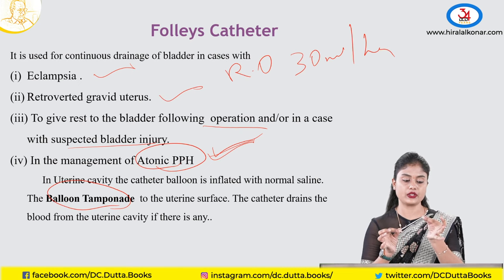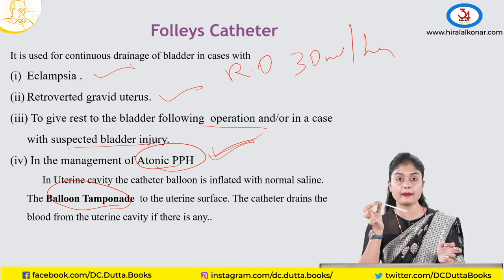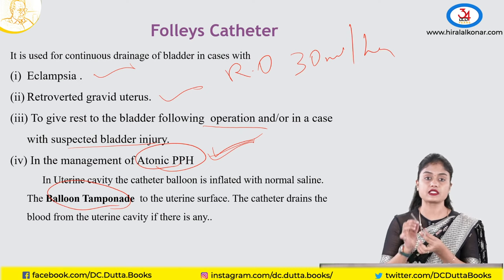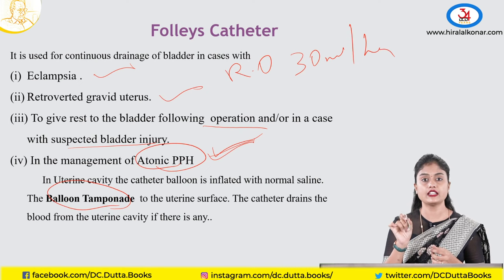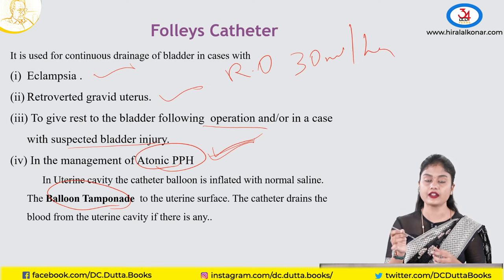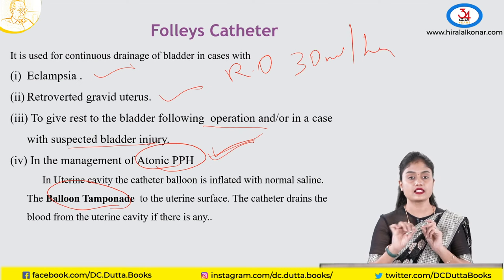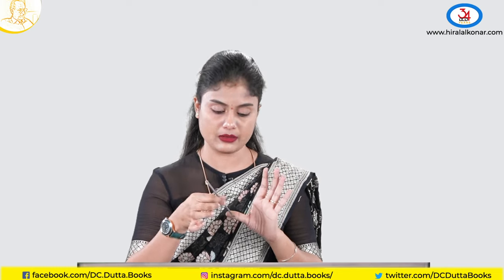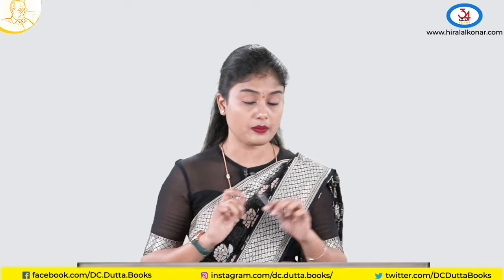This is a metal catheter — other than the rubber catheter or Foley's catheter. Being metal, it is reusable and goes for autoclave sterilization. We use the metal catheter in vaginal hysterectomies or cystocele repair, where you want to drain the bladder before the procedure and leave it. It also helps identify the extent or descent of the bladder during hysterectomy by knowing the base of the bladder.